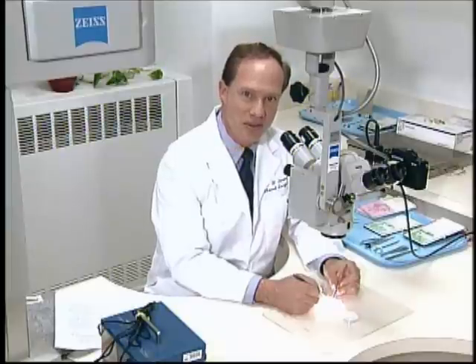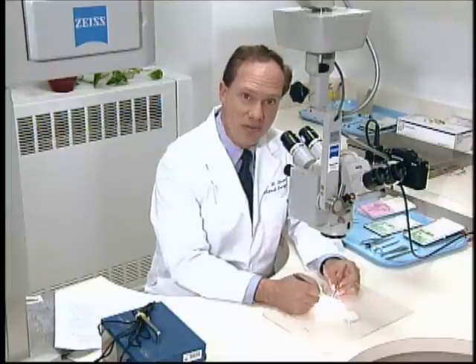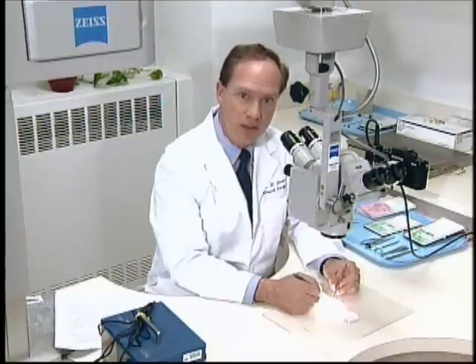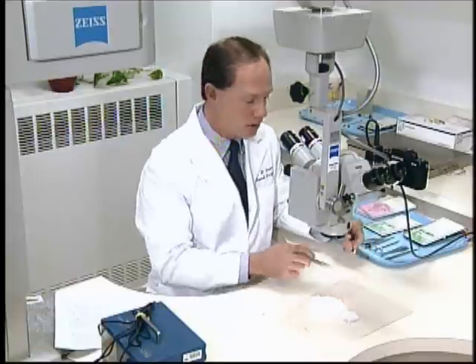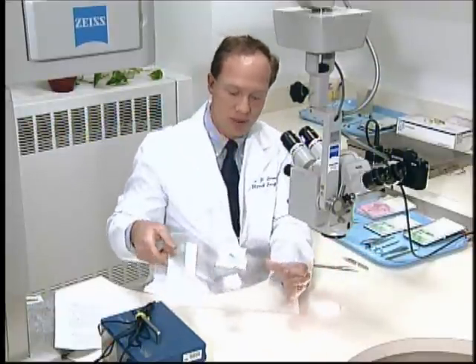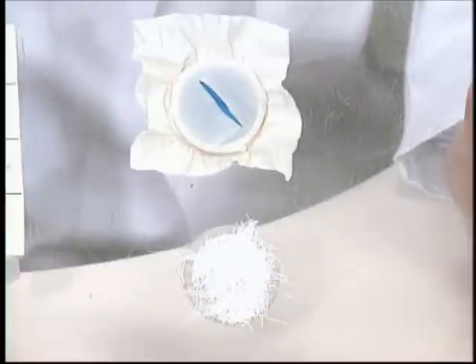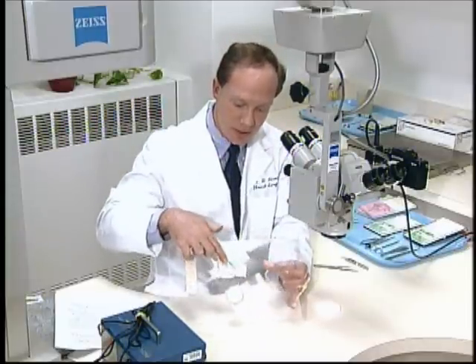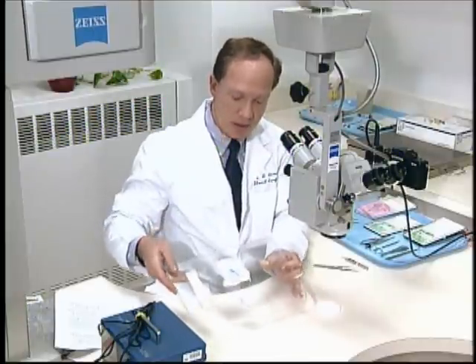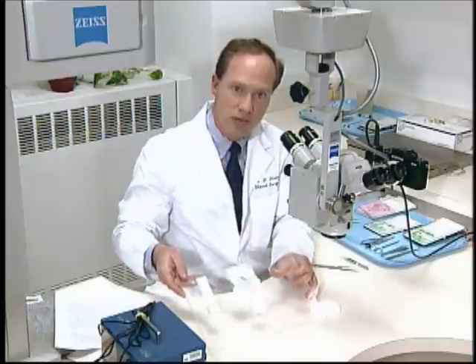Welcome back to the microsurgery laboratory. In this videotape, we will review the basic techniques for microsuturing using a practice model before we move on to the rat. The practice model is a piece of latex rubber stretched over a plexiglass ring with a cut in it, and the cut is what will be sutured. The ring can be rotated so that you can practice sewing in different directions.